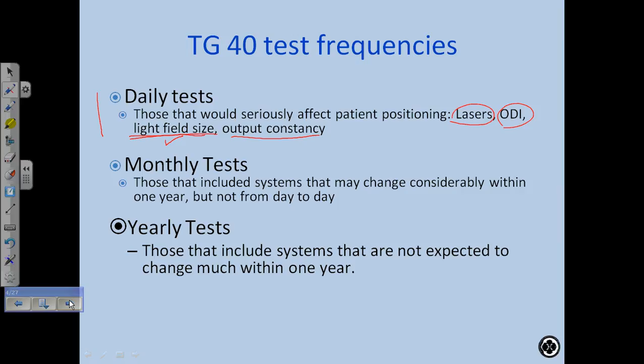So if you start a patient on an electron energy and you haven't monitored it in the past, you don't know what kind of record it has. So it's a good idea to just do all the energies. It doesn't take that long, especially today with the daily dose checkers. You just put it down on the machine, and then you can do everything from outside the machine. You don't need to go in the room.